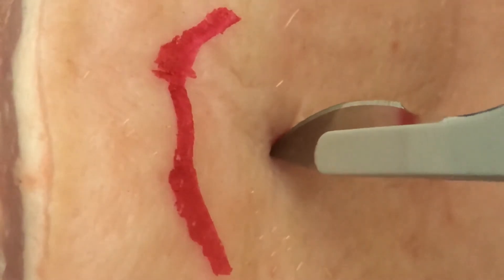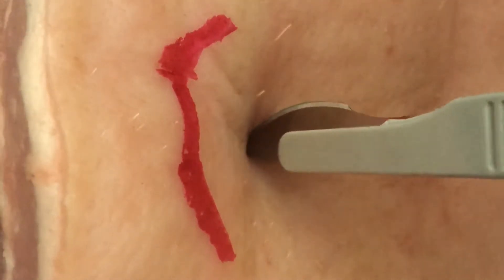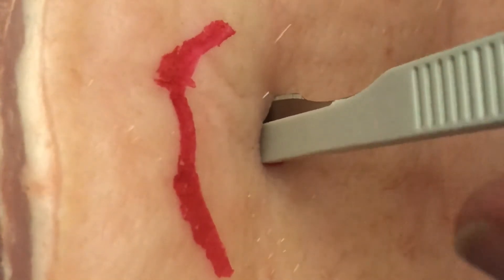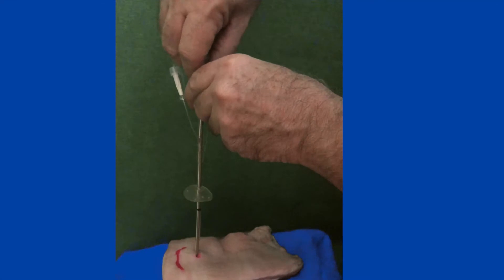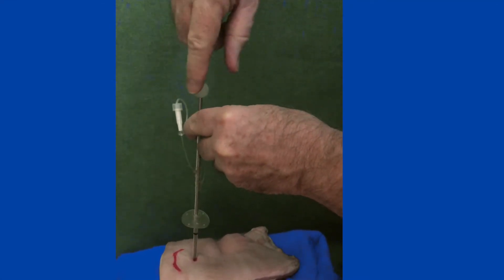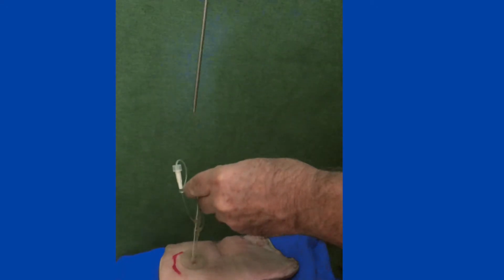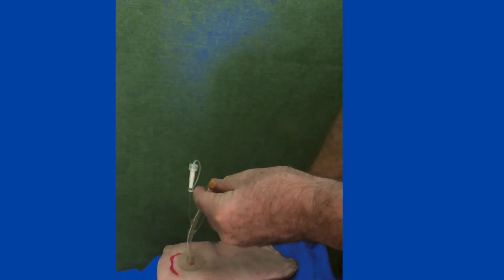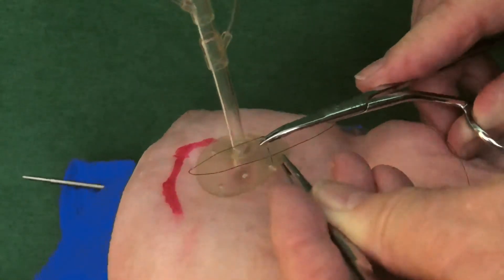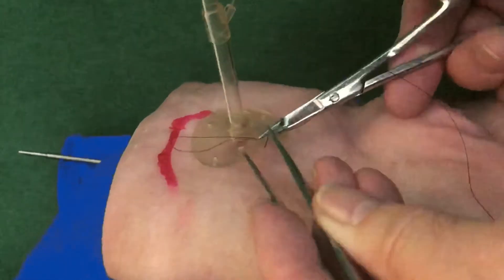A size 23 blade can easily be passed through the skin and down to the linea alba, which can be punctured with it, making it easier to insert the suprapubic catheter. The trocar is pushed through the incision into the bladder. The catheter is advanced and the trocar withdrawn, with a thumb placed over the end of the catheter to prevent splashing. The drainage bag is connected, the balloon inflated, and then the flange sutured to the abdomen.